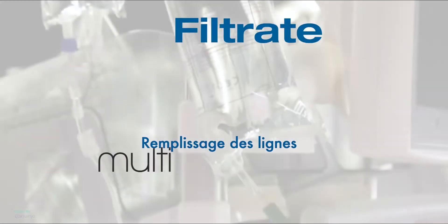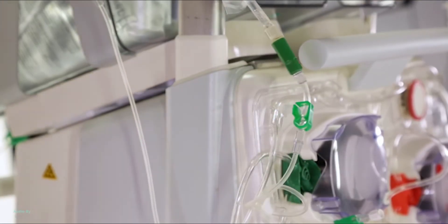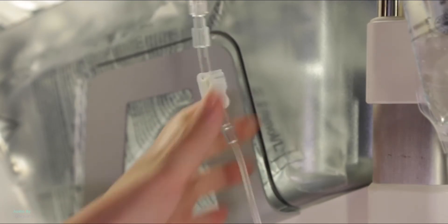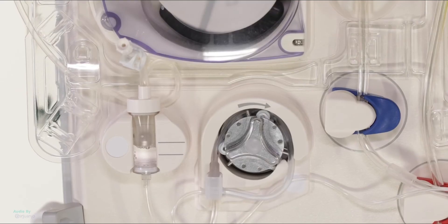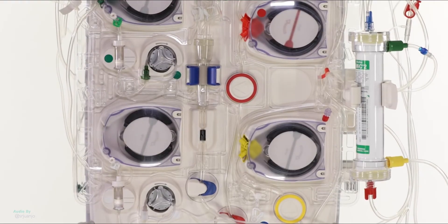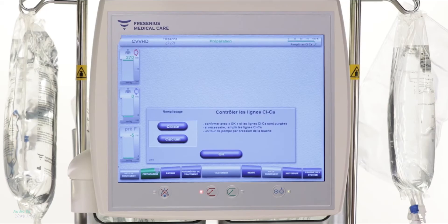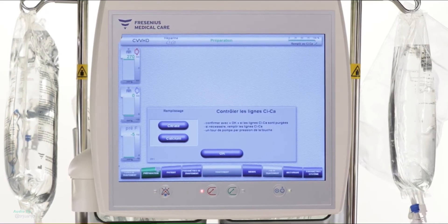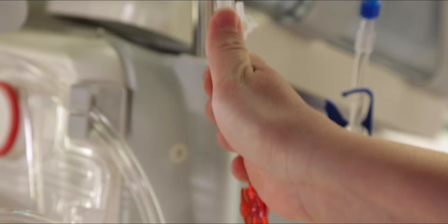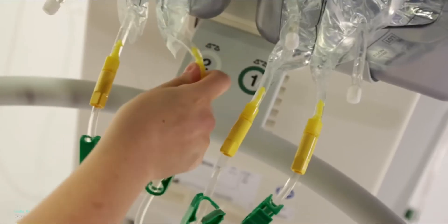Filling in the lines. To fill in the lines, break the cone of the citrate bag and open the clamp. The level is automatically set between the two markers of the drip counter detector. Break the cone of the calcium bag and open the white clamp. Continue by pressing the Start button. The filling of the citrate and calcium lines begins. Visually check that the citrate and calcium lines are free of air. If necessary, press the citrate or calcium button to complete the filling of the lines. Otherwise, press OK. Before starting the filling of the lines, open the red clamp of the access line. Open the three-way tap. Break the cones of the dialysate bags and check the tightness of all the lines.